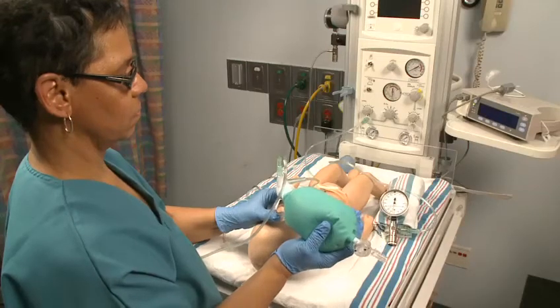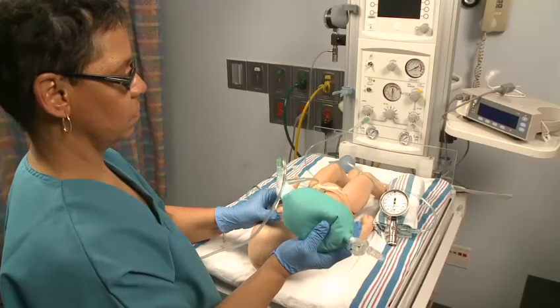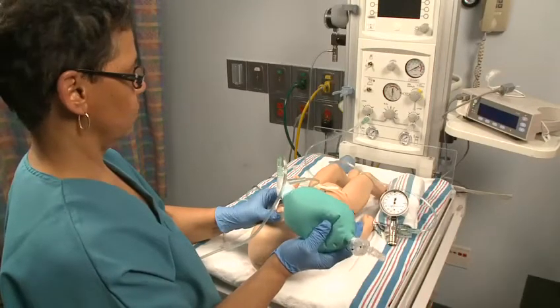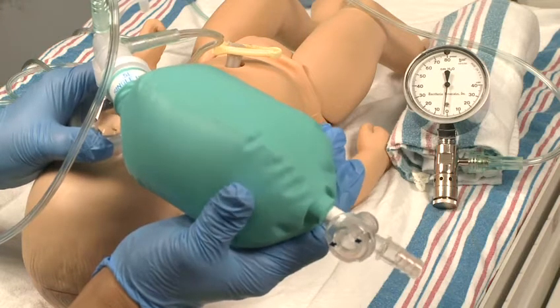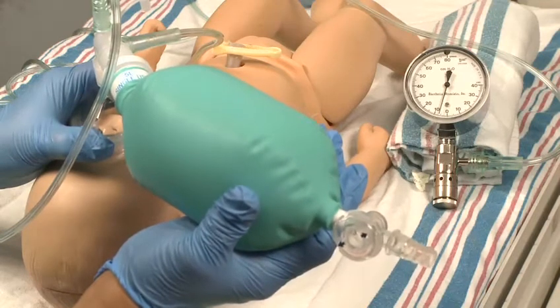Positive pressure ventilation is indicated when the newborn is apneic or gasping, has a heart rate less than 100 beats per minute, and/or saturation remains below target values despite supplemental oxygen. In this section, we will explain how a flow inflating bag works and how to use it.